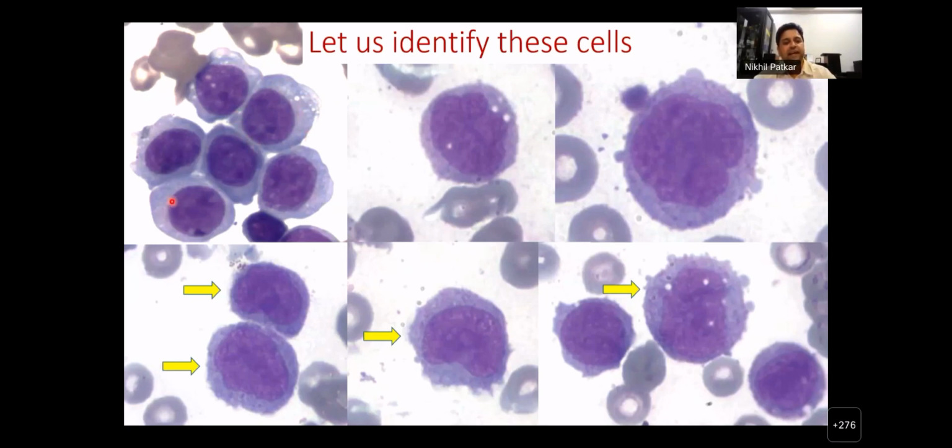Now you see these cells, their nuclear chromatin is pale as compared to a myeloblast. All right, some would say lace-like or whatever, but it's pale with abundant cytoplasm, which is largely devoid of granules, and there are vacuoles, as someone rightly said. Now, what do you think these cells are? Promonocytes. Monocytes. Why would you say they are promonocytes? What argument would you have?